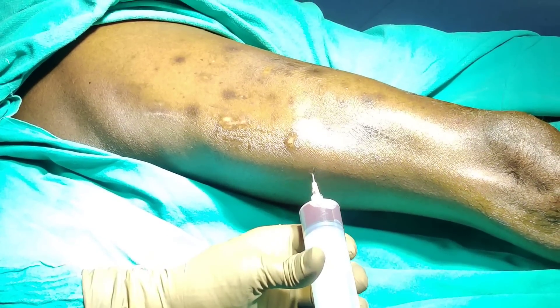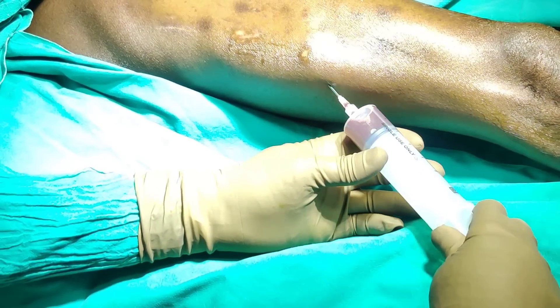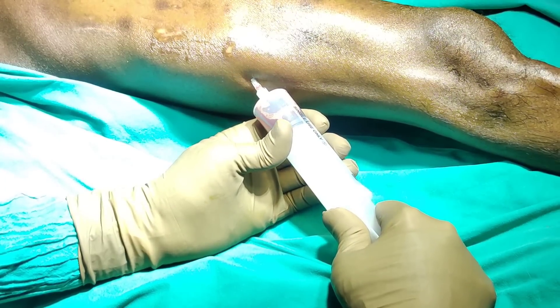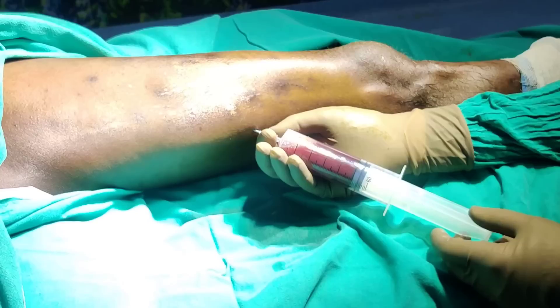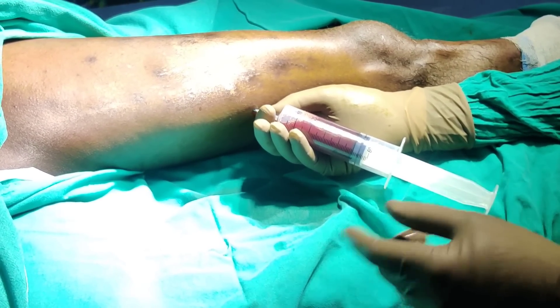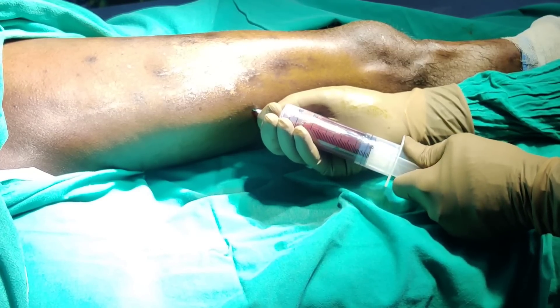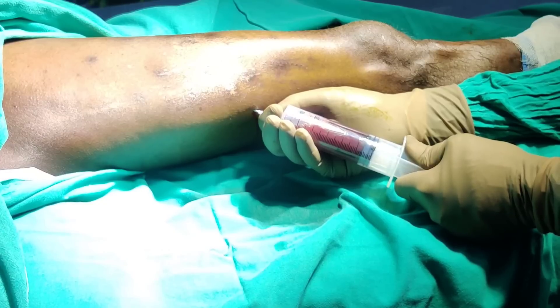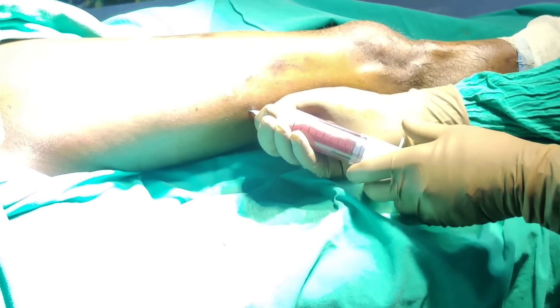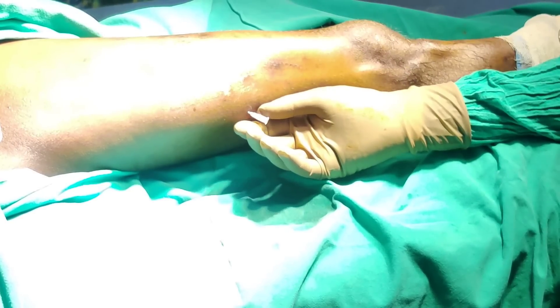As mentioned in my introduction, this is usually a hemoserous collection, so you should be able to aspirate quite easily. I have aspirated around 50 ml. I shifted my position as I was not comfortable from the other direction. You can see the red-colored fluid — this is due to rupture of capillaries as well as lymphatics. We have aspirated 50 ml here and 30 ml before, so around 80 ml so far.